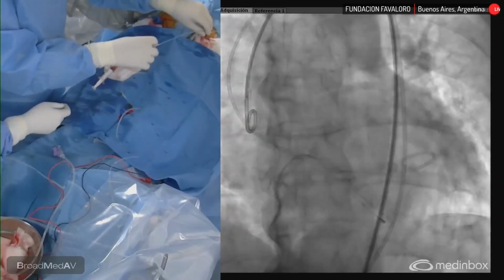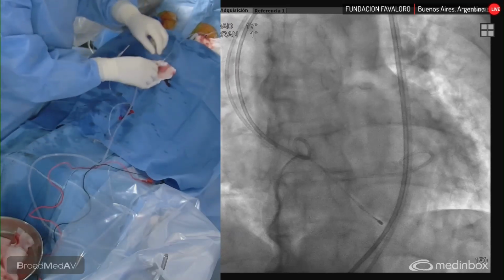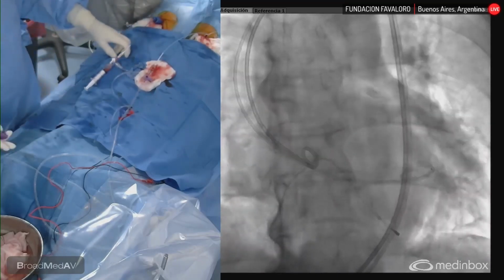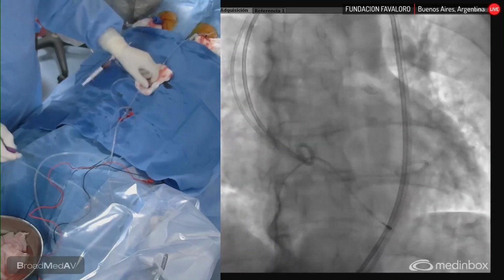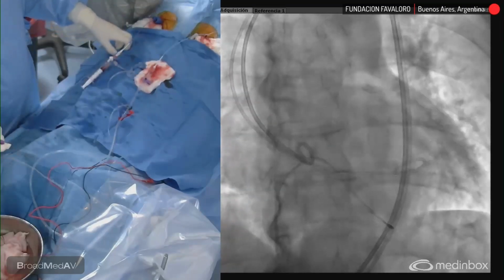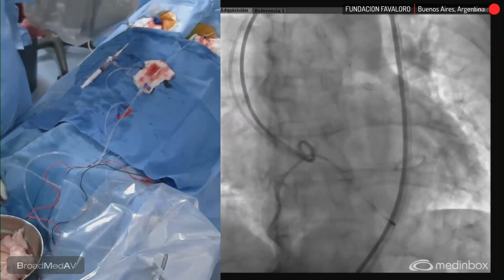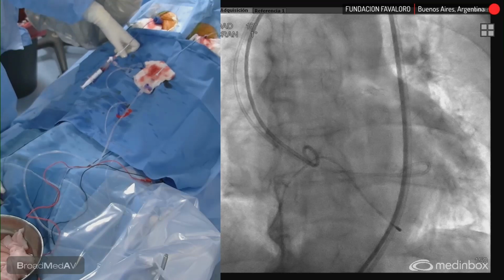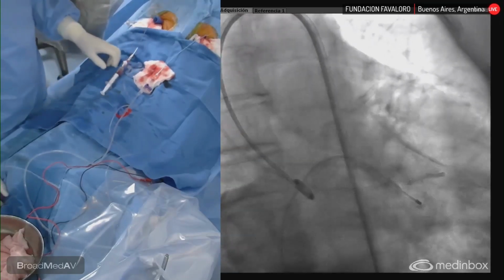Meanwhile, one of the comments I was about to make is that we were talking in the morning with Dr. Fava, who is on my right side. He was reviewing our last 2 years of data, 200 procedures with self-expandable valves using the cusp overlap implantation technique. We observed that patients without previous conduction disturbances have a permanent pacemaker rate of 3%. But in patients with conduction disturbances, the permanent pacemaker implantation rate is 21%. Is that correct, Carl? Yes. Correct, okay, 21.